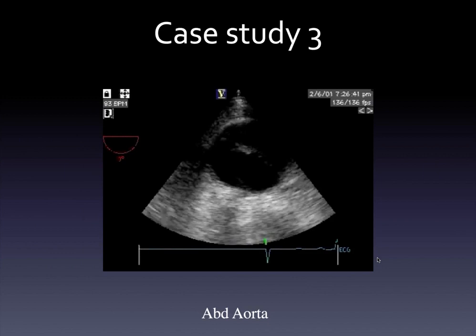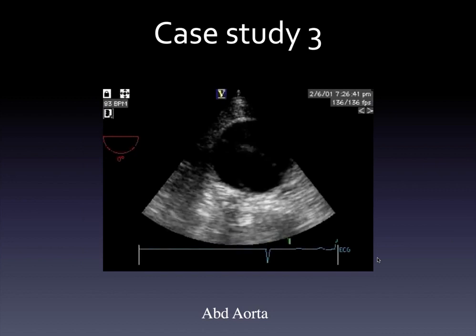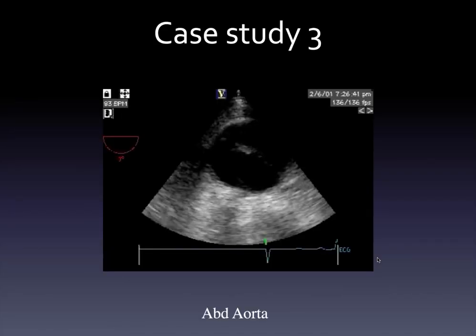It's very weird. Okay, so this is the abdominal aorta. You put a probe and then you see a very dilated aorta. And what do you see in the abdominal aorta? Can you see the movie moving? Yep, I can see a still image for me. I assume it's meant to be, but you can see a linear density across the abdominal aorta there.